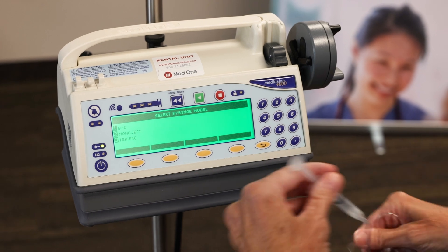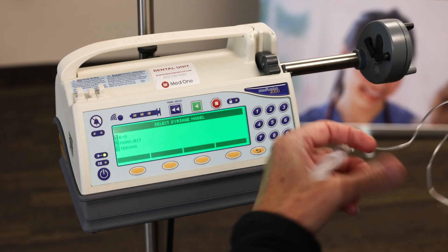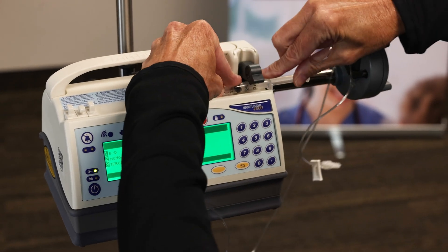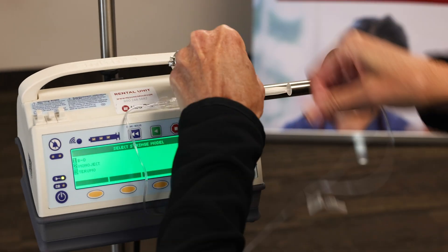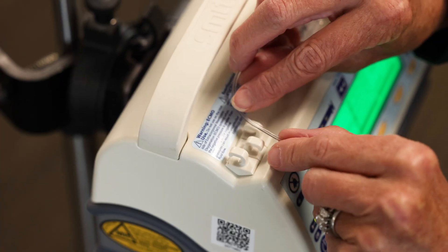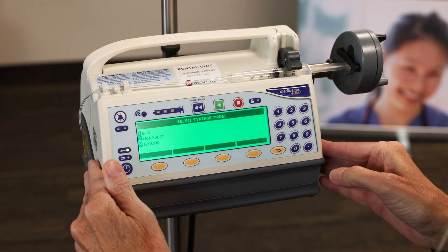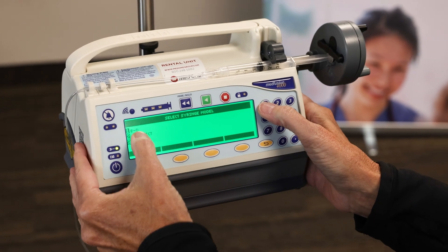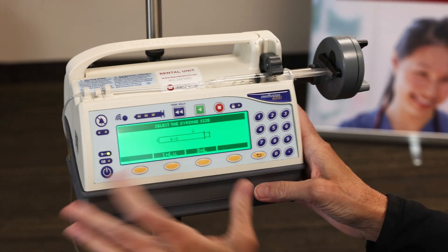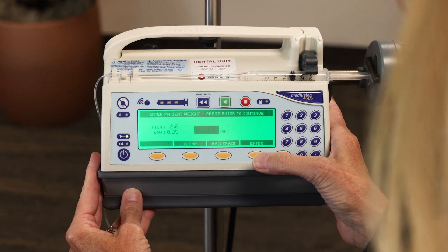Now I'm going to load my syringe while releasing all the barrel clamps. Let me lift it up, position it in, squeeze the flange, and then load it into my tubing clamp so it reduces any kinking in our line. I'm going to choose BD because that's what I have — a BD 3mL. It gives me a one or a three choice; make sure I hit the three, then confirm that's what I have.